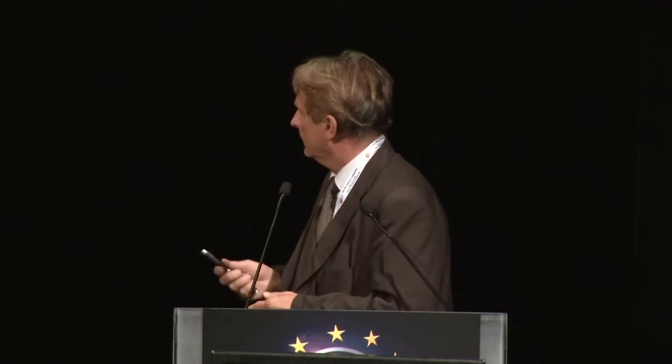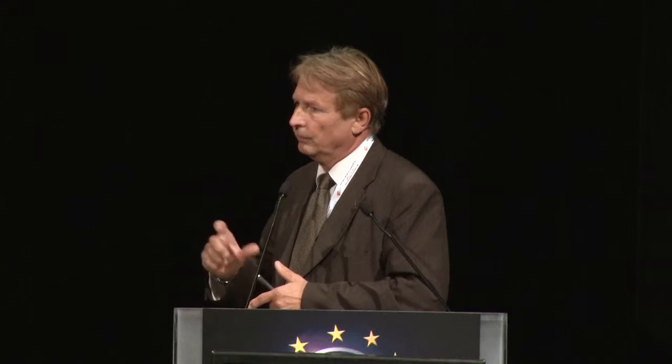The first question is why I decided to put it beside, because I needed to create an anatomy, a space where I was able to see where the infusion was, and not have the infusion under the retina or under all those membranes. And the second is because I usually perform this change before the corneal transplantation, because I don't need any change of movement on the endothelium of the cornea.